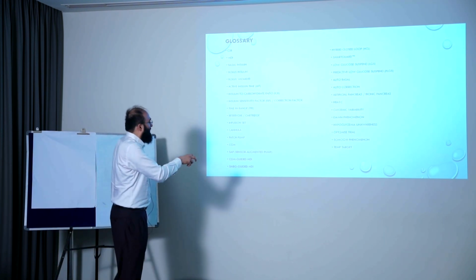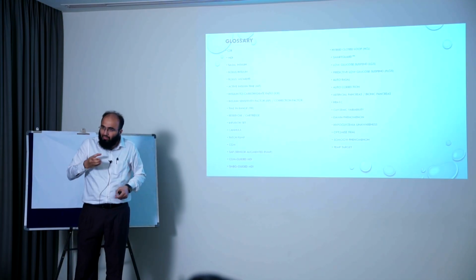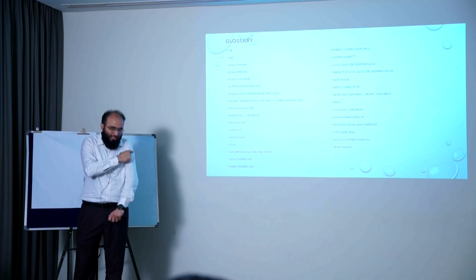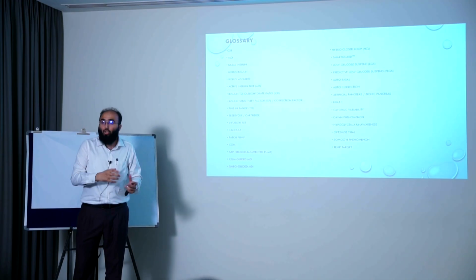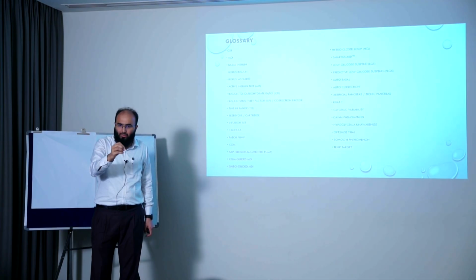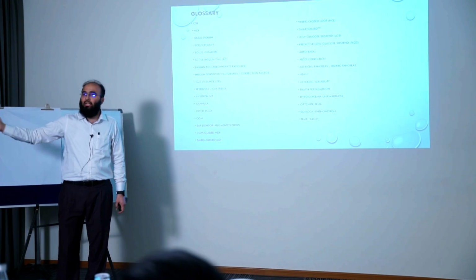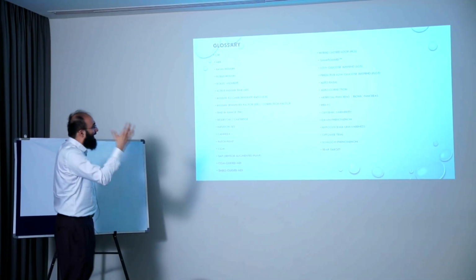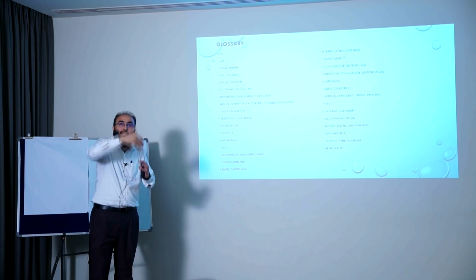That's SMBG guided MDI. Hybrid closed loop is that integration of the pump with the sensor signals. So there's a transmitter with the sensor which transmits the interstitial glucose values to the pump, and this pump auto adjusts. The advanced pumps like the 780G, they check your sugars 288 times per day and adjust the rate of insulin delivery. That's literally every 5 minutes. 1 hour, 12 times. And Smart Guard is that feature which prevents hypoglycemia and gives auto corrections when sugar is going up.